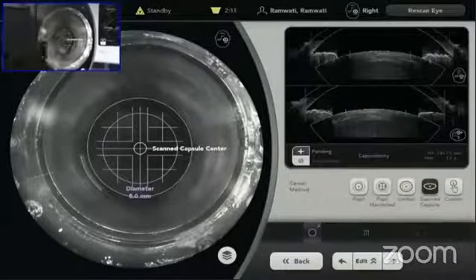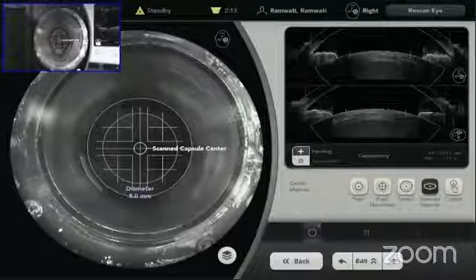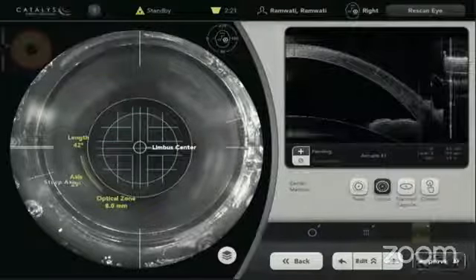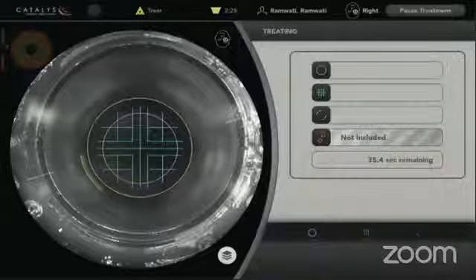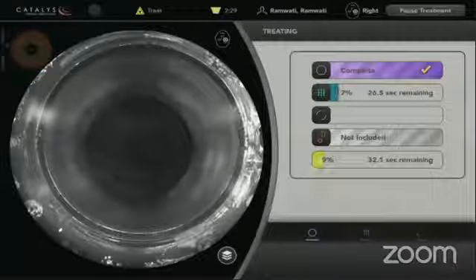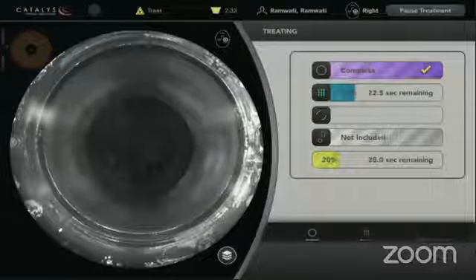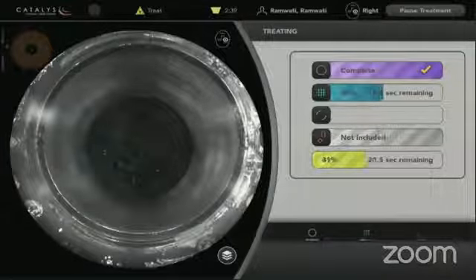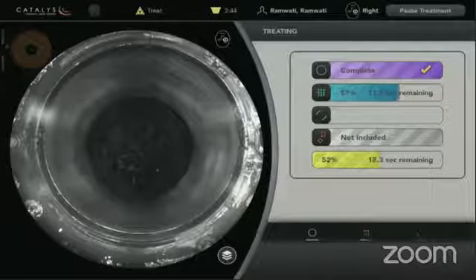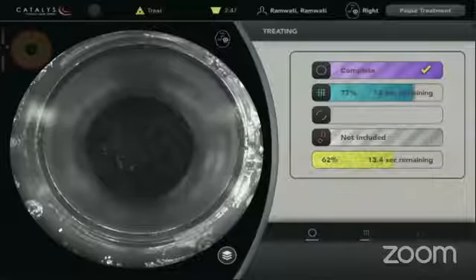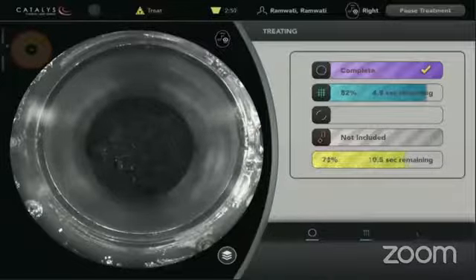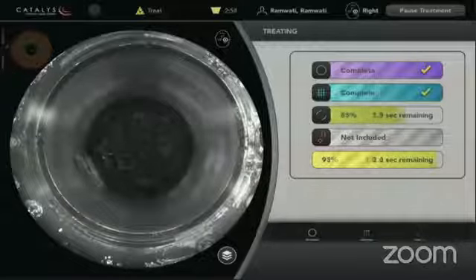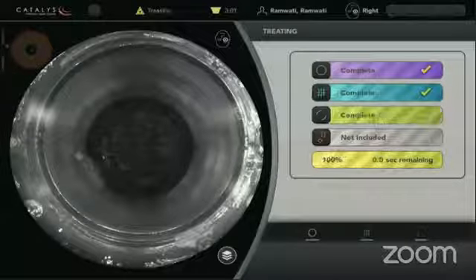You can see 5 millimeters — everything is fine. This is the LRI; I am not doing the incisions. We are going to start and I am going to fire the laser. This is the capsulotomy, completed in about 1.2 seconds. Now this is the nucleotomy happening — 18 seconds more, total time left is 20 seconds. This includes the time for the LRI. Once you see these air bubbles it shows that the capsulotomy should be pretty good. This is the LRI — and that is complete.